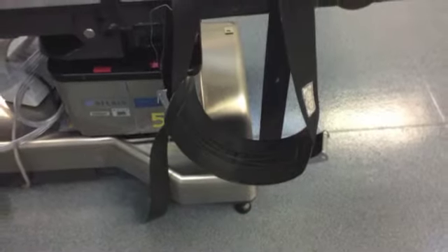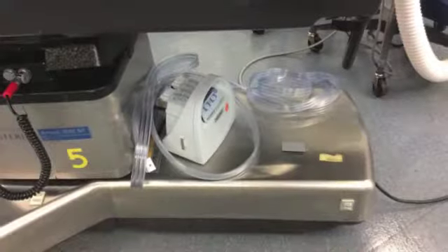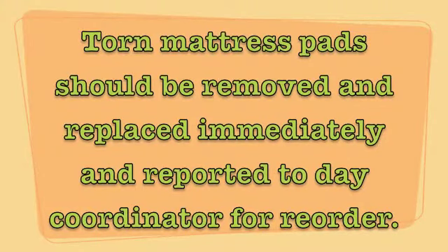Assess the integrity of your mattresses, padding, and so on. If integrity is compromised, pull out of service and replace with stock. Report any issues to the day coordinators. All safety straps and equipment should be cleaned and placed on clean equipment, not on the floor.